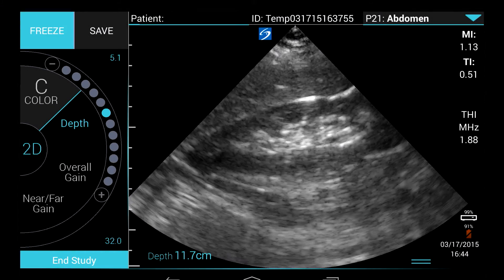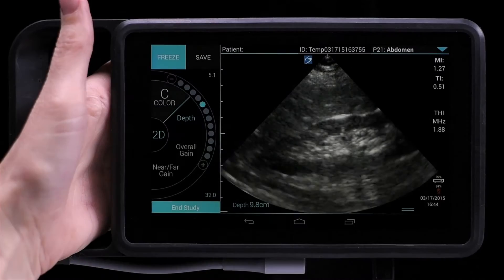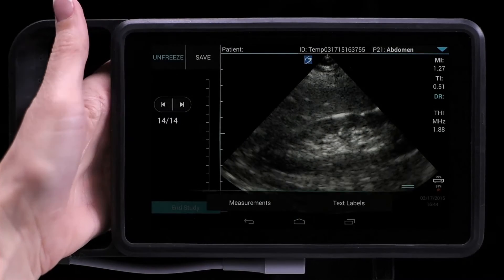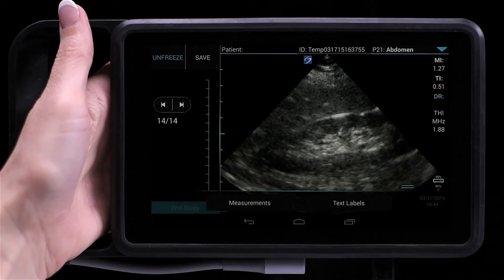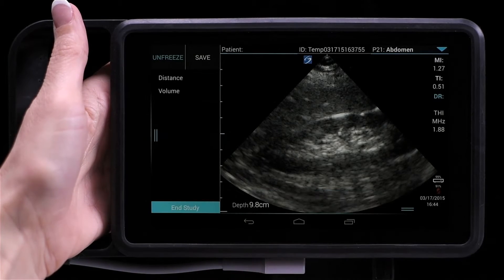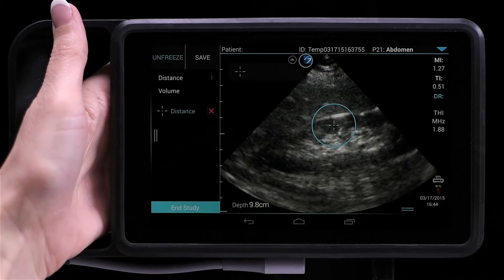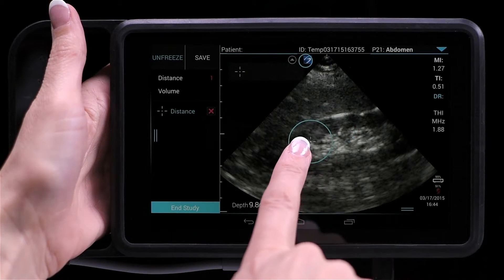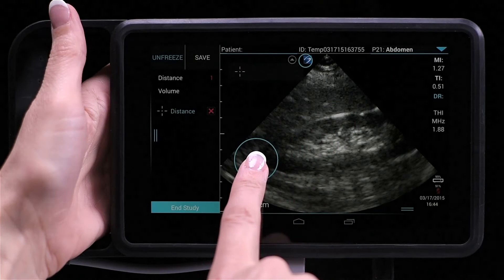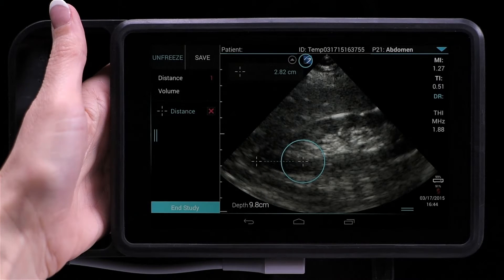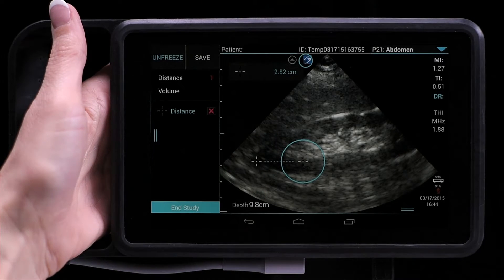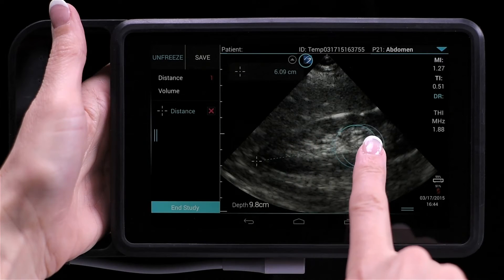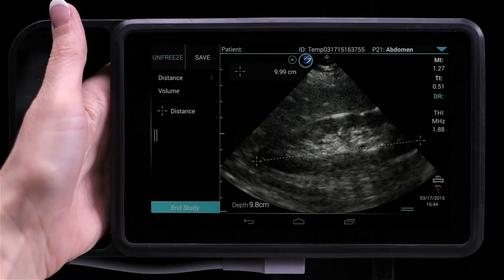While scanning, freeze the image. Tap Measurements and choose either the distance or volume measurement. Drag the active caliper to the start of your measurement. Lift your finger to activate the second caliper. Slide and place that caliper at your end point. The measurement appears on the top left side of the screen.